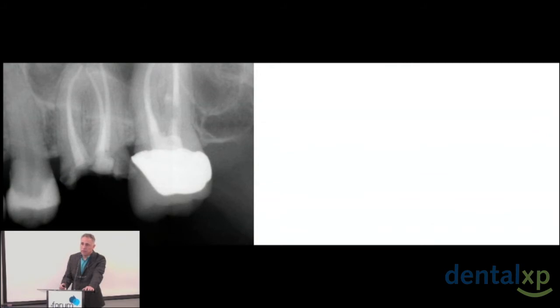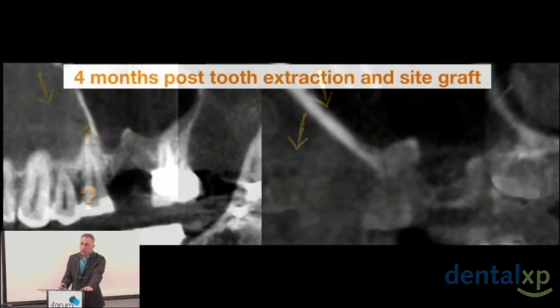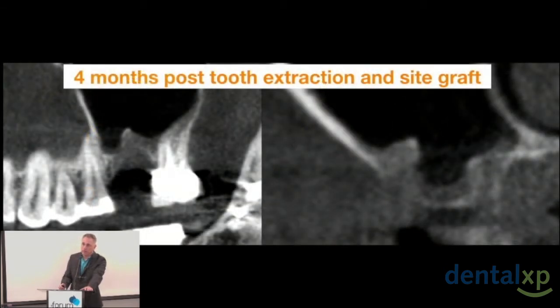And we look at another patient, again, that also has tooth number 14 planned for extraction, and we can see the periapical X-ray with what we think is the sinus floor outline, and it's really difficult to know exactly the dimension. In fact, when we do a CT scan, now we can appreciate the extreme nature of the sinus pneumatization between the roots and also the apical region, and now we have a much better image and plan to be able to do the extraction in a more predictable fashion.